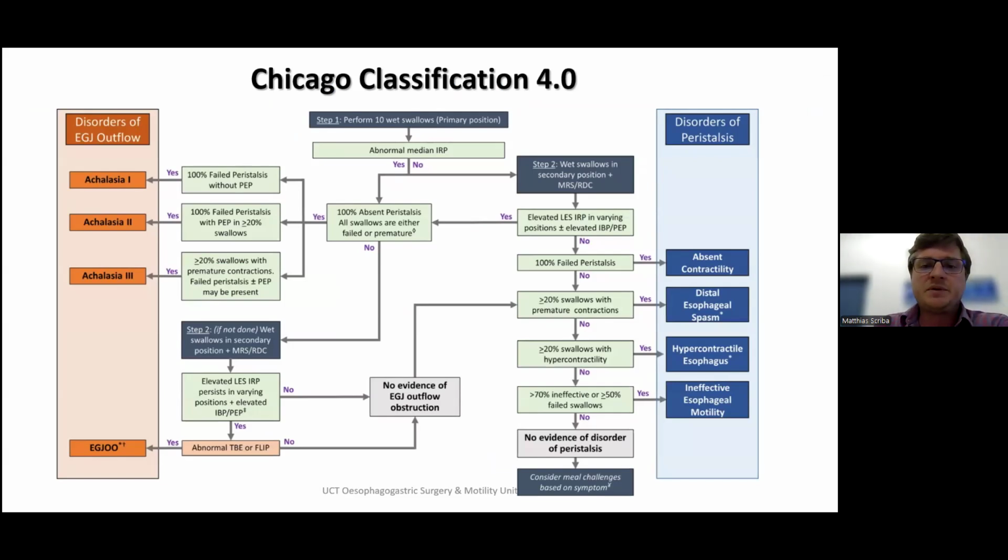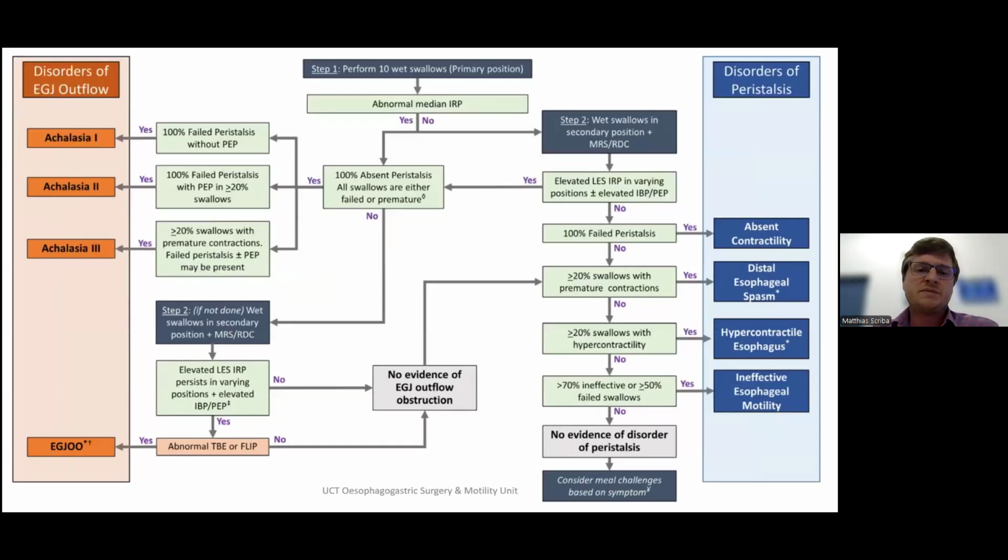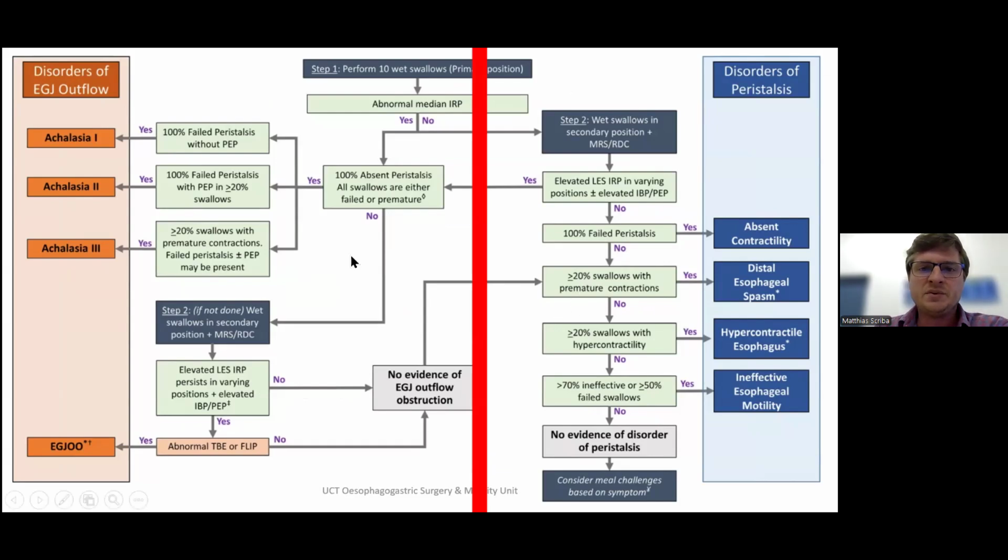But basically we land up with the most important table or figure from the entire paper, the flow diagram we use to make these diagnoses. It looks very busy, but let me try and see if I can simplify it for you. The first thing we do, remember I spoke about the IRP, is we look at the IRP first. So is that high or not? In other words, is there lower esophageal sphincter outflow obstruction or not? As soon as we say yes, we move down this pathway to the left. If we say no, we move to this pathway to the right.